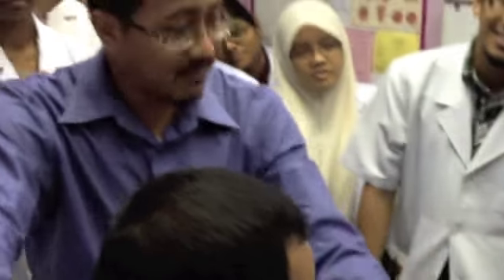Explain that you want to examine the ear. Verbal consent. Next, mana dulu? Inspection. Walaupun orang cakap right ear, you have to inspect both ears. So you stand in front of the patient and then I can see both ears are normally located. How do you know whether it's normally located? Eye level.